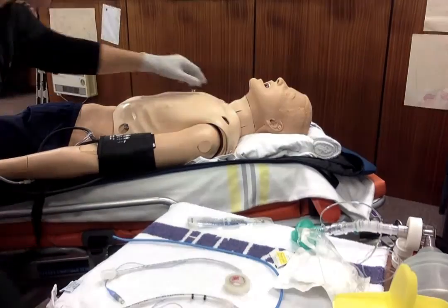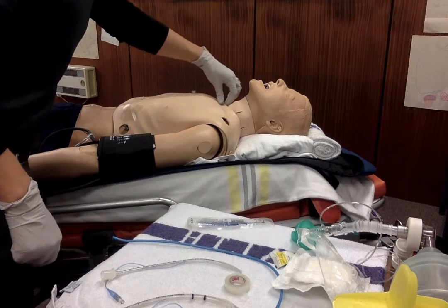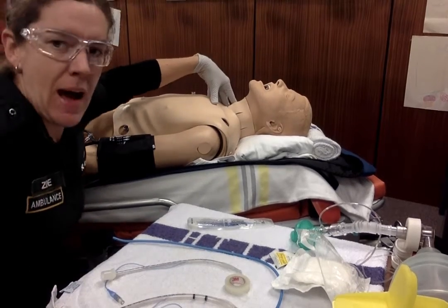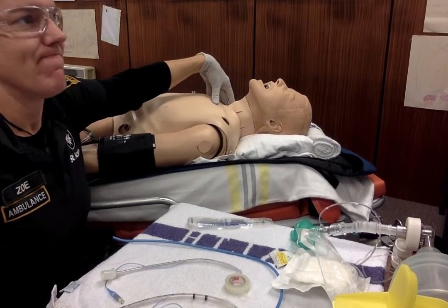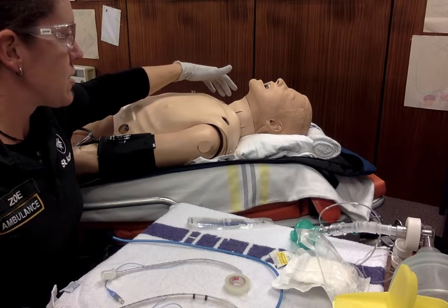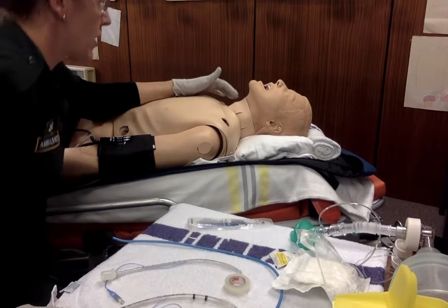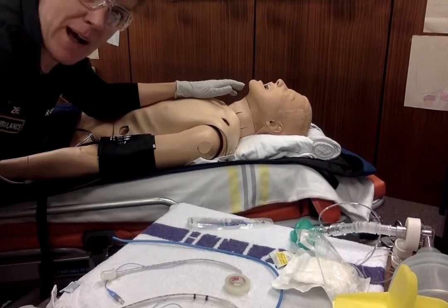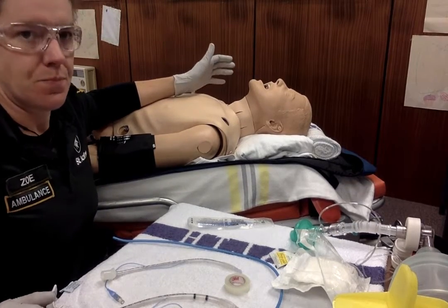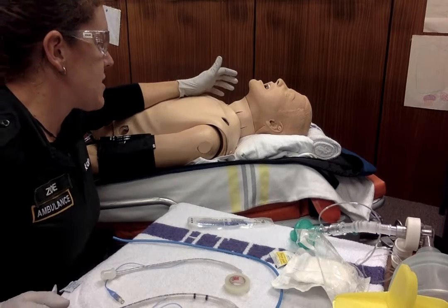So we're going to have a quick look at our patient and assess how difficult their surgical cric might be. You can use this using SMART or SHORT. I use SMART. We're looking at the area where we're going to do the procedure and looking, have they got any evidence of past surgery in that area, scars, masses, which is M. A is for access or anatomy.